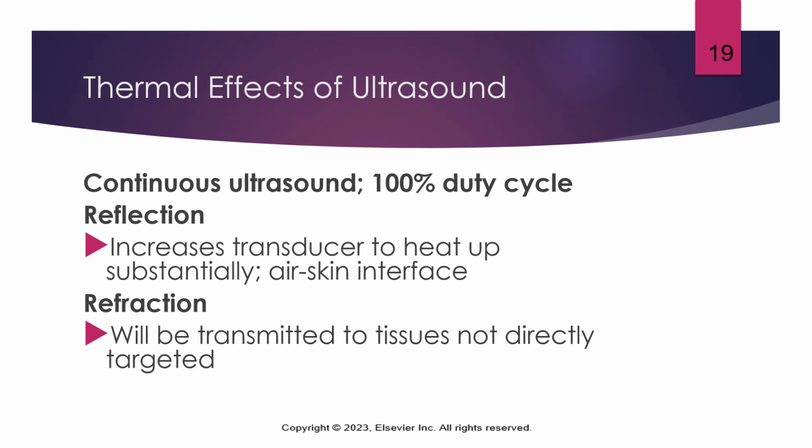And if you ever need to pause the treatment to add more gel, that's perfectly fine. You just need to make sure that the actual transducer head is not producing sound waves whenever you're taking it off the skin. And you also want to make sure that you're not just leaving it directly on the skin while the energy is being produced and passed into the skin.